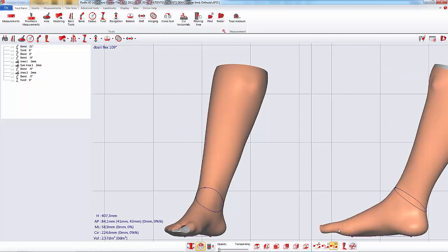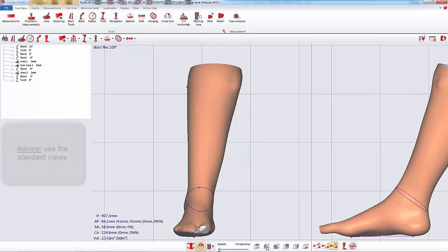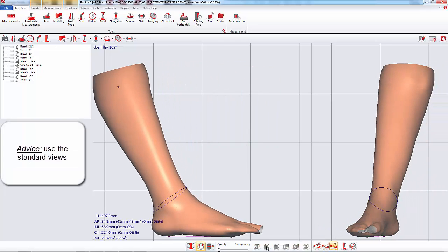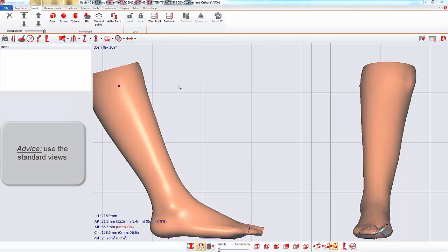The 90 degrees synchronization can be useful to place inserts. For the positioning of inserts, we advise you to use the standard views.